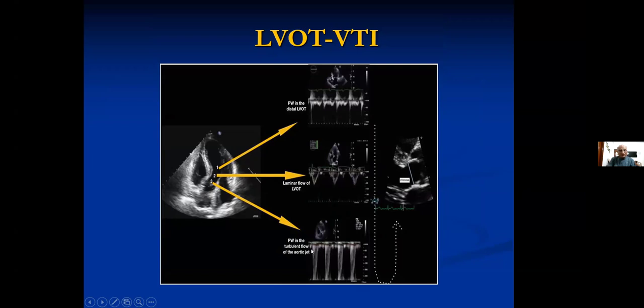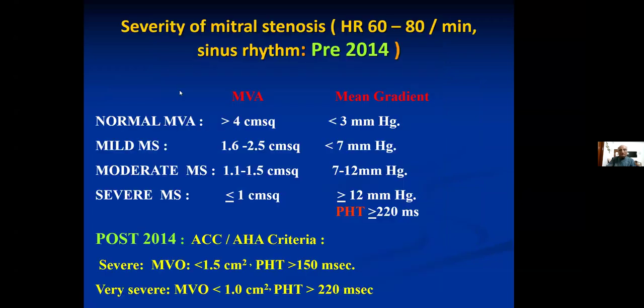If you put it very close to the aortic wall, it will be increased. If you put it very distally, it will be decreased. Put it almost in the center, by moving the sample volume up and down and see where you can get the best tracing also. So try to measure stroke volume as a practice.